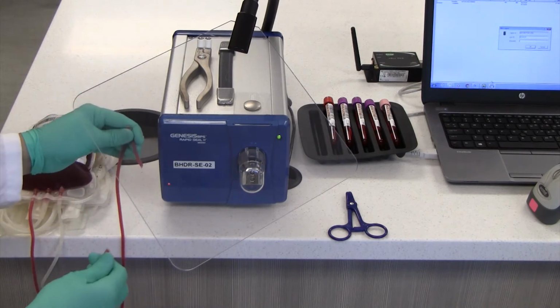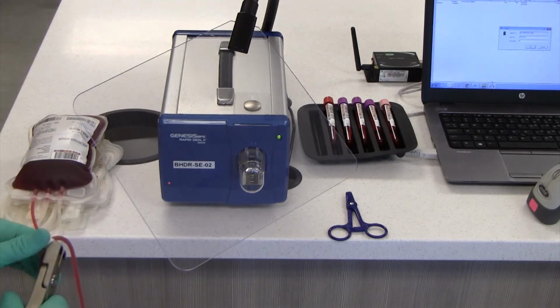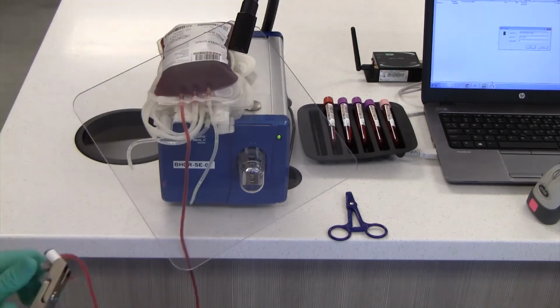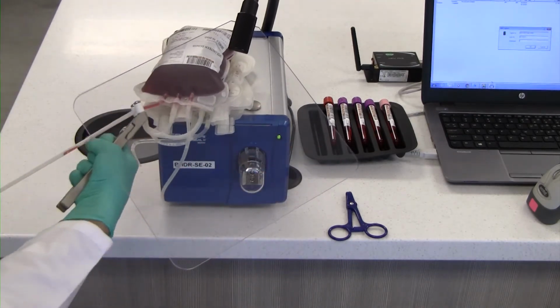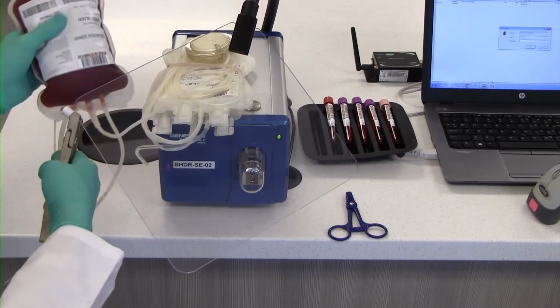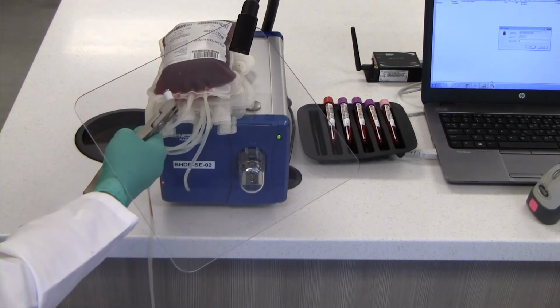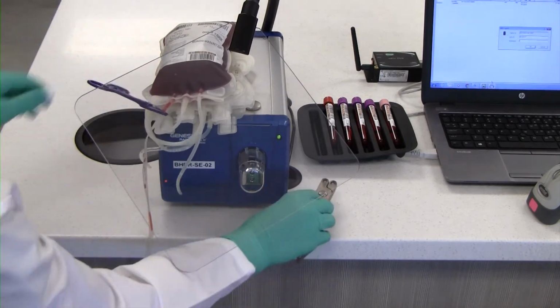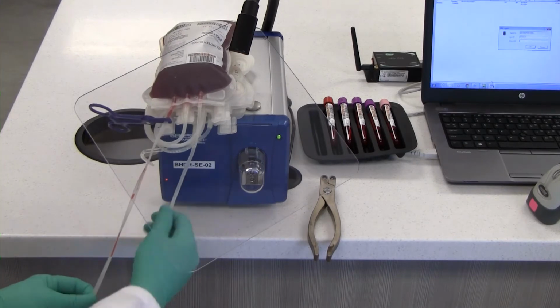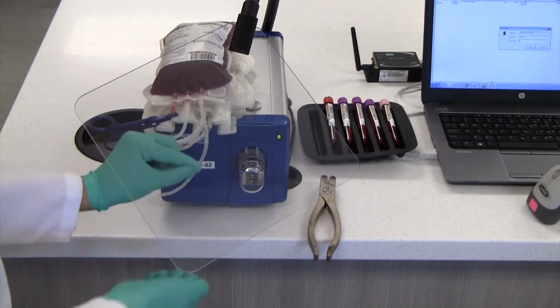Detach tubing at seal, discard needle, PPD, diversion pouch, and tubing. Strip the blood in the tubing from the seal into the collection bag. Gently mix the whole blood. Clamp a hemostat on the tubing behind the stripper. Seal tubing approximately 9 inches from the collection bag. Separate tubing at the seal and discard.